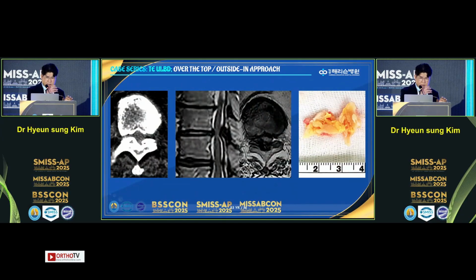I already mentioned that endoscopic decompression is also very important for performing all degenerative spinal disease. Dr. Lloyd mentioned, and I have also already mentioned, that to safely perform endoscopic decompression, always keep the over-the-top, outside-in approach: first drill, and finally take out the ligamentum flavum. I will show this video tomorrow. Today I will only show the cases.